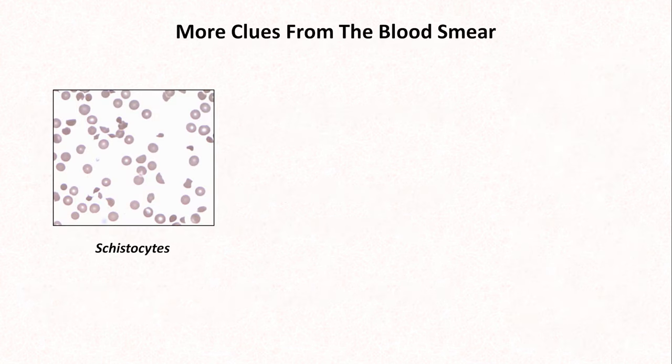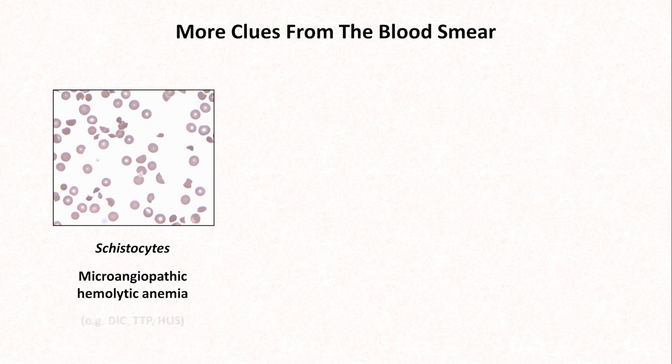Megaloblastic anemia is most commonly caused by vitamin B12 and folate deficiencies. Here we see many examples of schistocytes, which are the fragments of RBCs seen in microangiopathic hemolytic anemia.